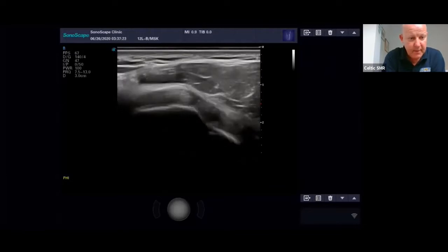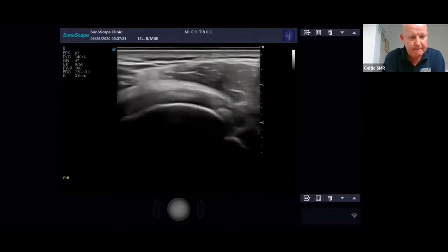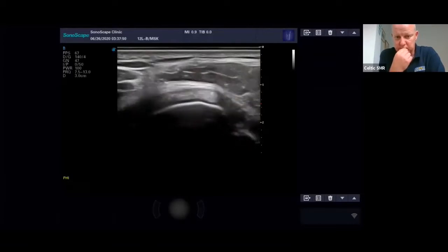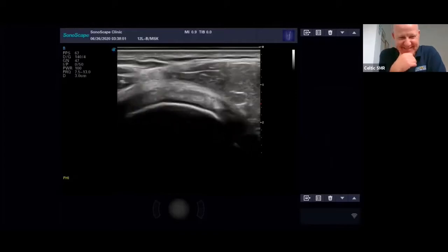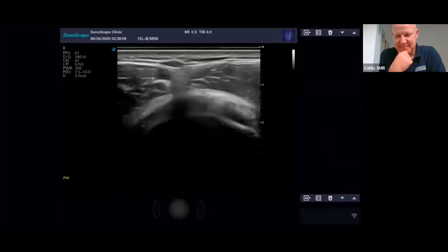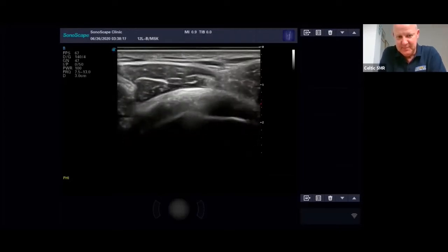To differentiate the tendons, as I say, it's quite difficult because they do merge. So you need to find that landmark there, which is your superior facet and your middle facet, and you know infra is going to be here. There's going to be a bit of supra coming over and a bit of infra coming over, but that's essentially how you differentiate them. Now, without being too rude to Abid, if you get a real slim patient, sorry Abid, you'll see the differentiation quite nicely. And what you can do is, it's probably a bit difficult on this, but when I move the probe, just get back, just slightly out there. Let me get back there.